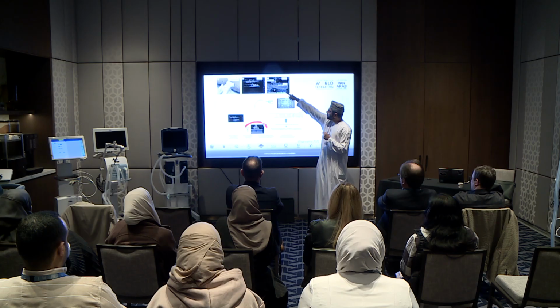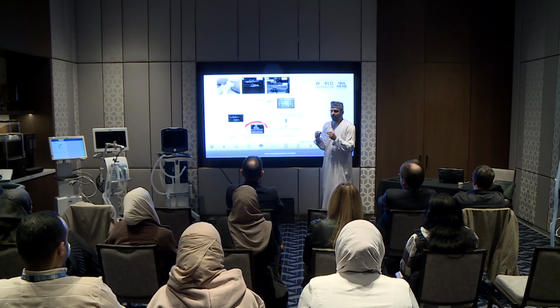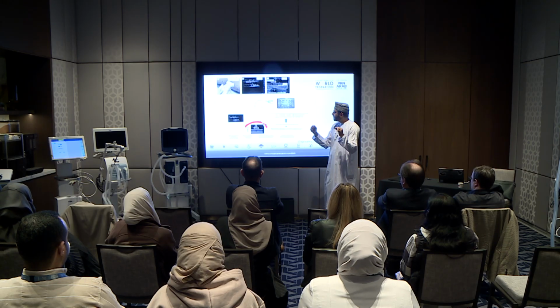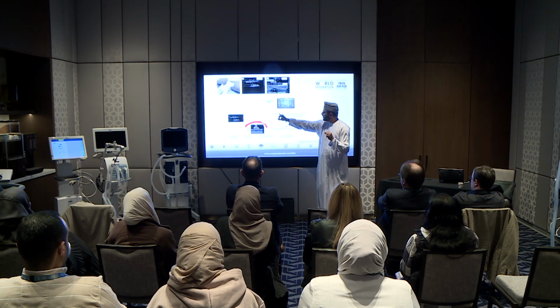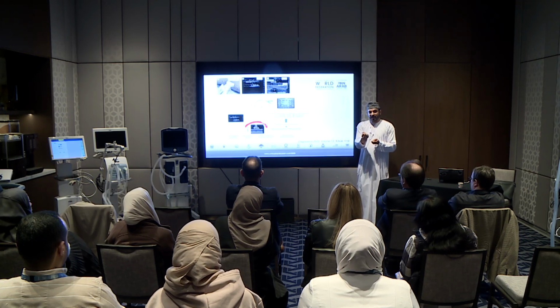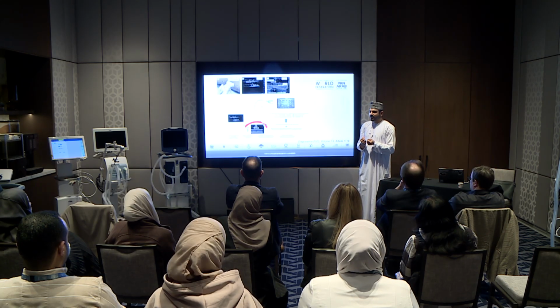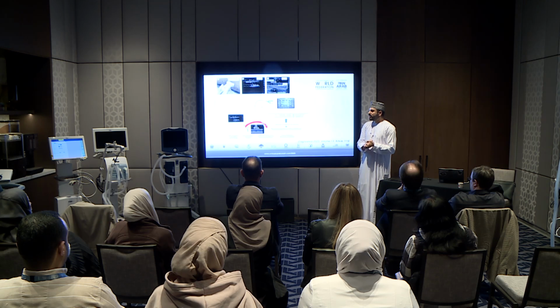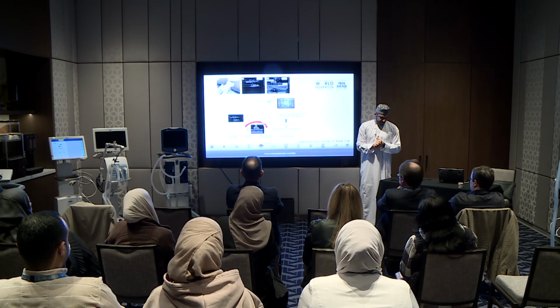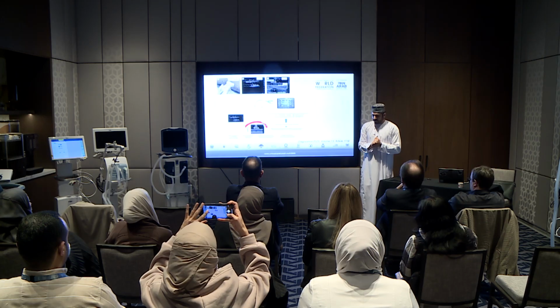When the patient breathes, the diaphragm will become thicker, yeah? Then you can calculate the thickness fraction. A thickness fraction of 30% or more tells you the effort is very vigorous, and maybe you need to do something to reduce the effort in a patient with extremely high effort.